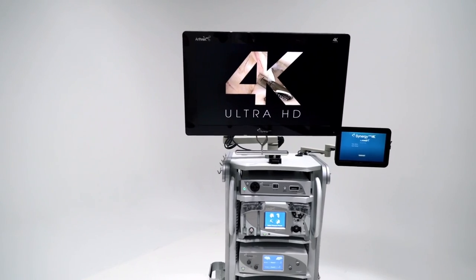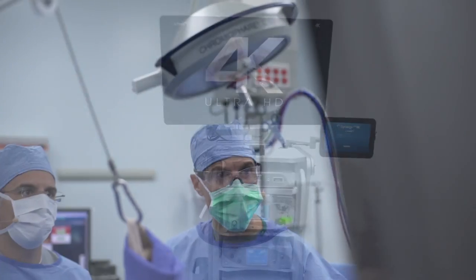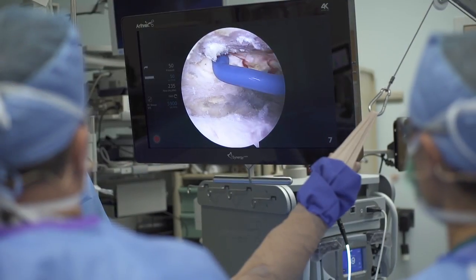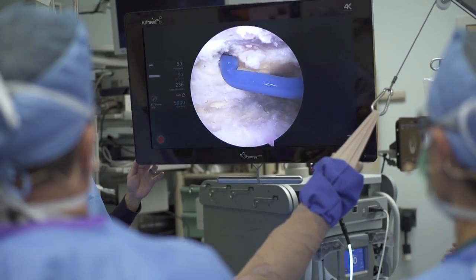The 4K arthroscope was connected to the Synergy 4K video platform and we were able to compare it to the typical high-definition video platform. This was a side-by-side comparison of the video towers, so I was able to achieve an objective view of the two systems in the same environment.